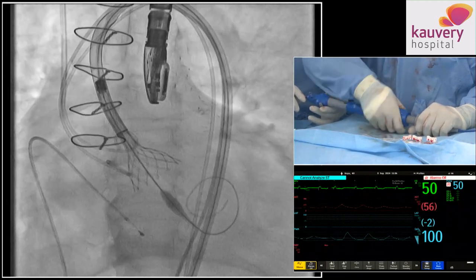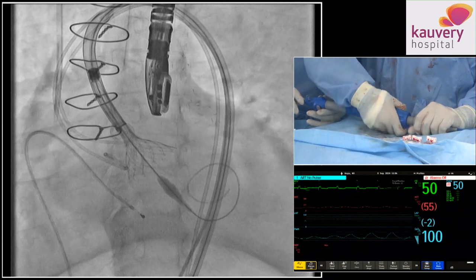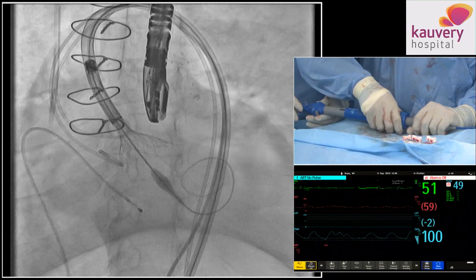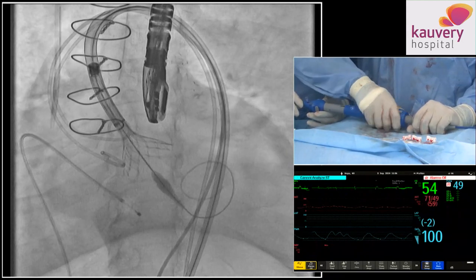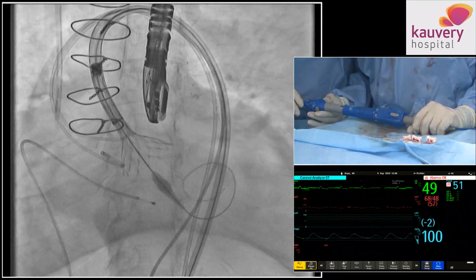It's a bicuspid, so you can be even now, at zero level. Yeah, we are trying to be. We now start releasing. It's okay. Start releasing. We are in good position.